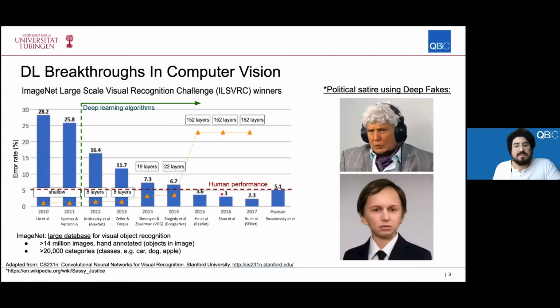So this is a very compelling, attractive argument to use these techniques to analyze biomedical data. And there's also a qualitative argument. As you can see, there are also generative models that have been used to create synthetic images for video, which are now very hard to distinguish from real video.